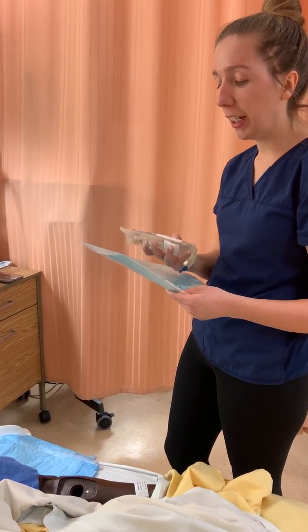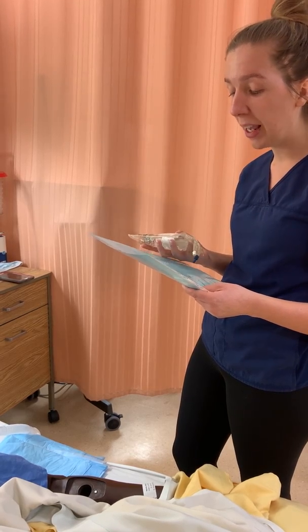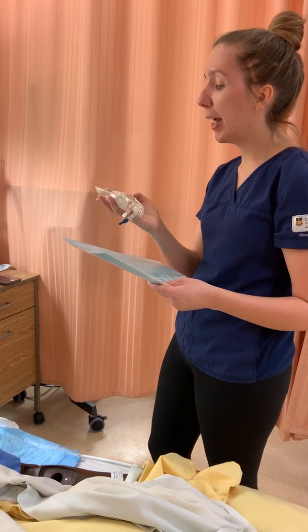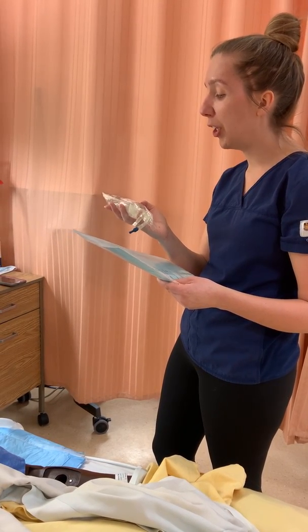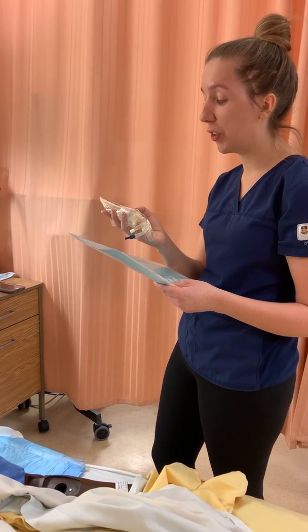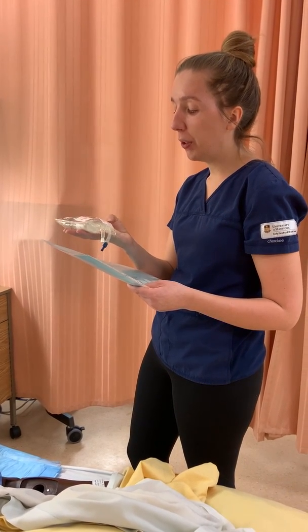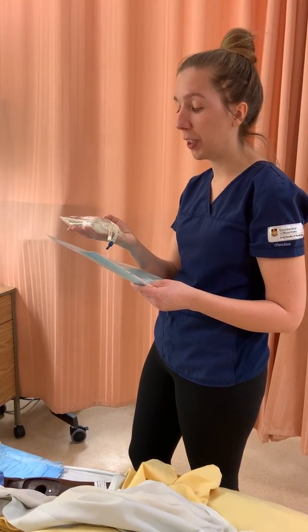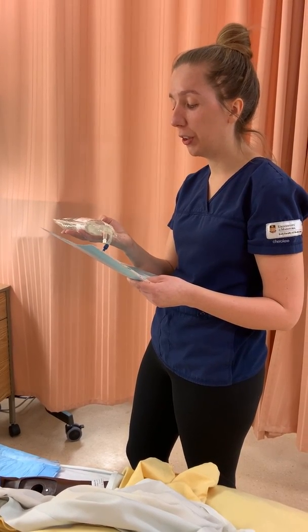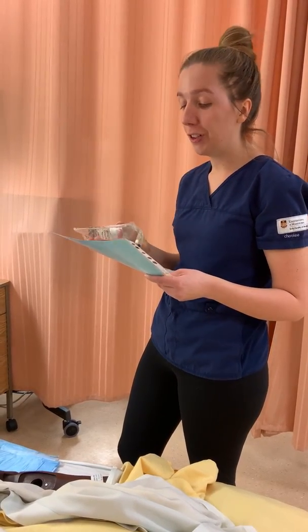I'm now going to look at the medication. I need heparin. I have heparin on my label and heparin on the bag. I have the correct medication. I need 1350 units an hour, as I wrote also on my label. I am able to retrieve 1350 units an hour because my bag has a final dose of 25,000 units, a final volume of 250 mLs, and a final concentration of 100 units per ml. As indicated on my label, I also wrote down the dose of 25,000 units, the volume 250, the diluent 250, and the concentration of 100 units per ml. So I am able to retrieve the correct dose of 1350 units an hour.